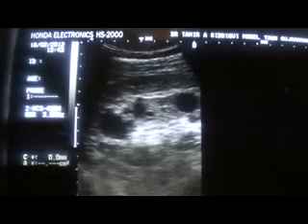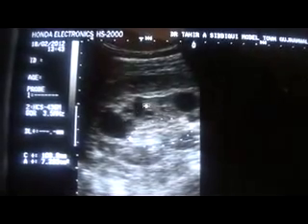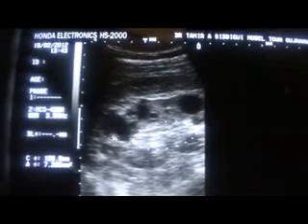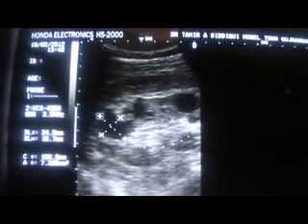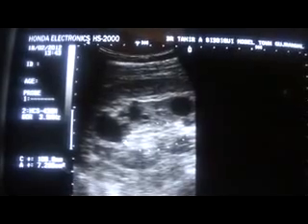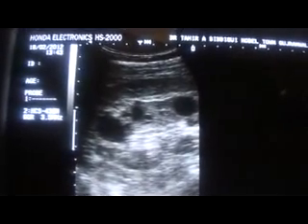In this case of multicystic kidney, you see the central sinus echo complex is present. The cysts do vary in size, but they have regular margins. This is the largest one, which measures 24 to 18 millimeters, whereas in polycystic kidneys, they vary in size between 15 to 20 and are seen above the age of 40 usually.